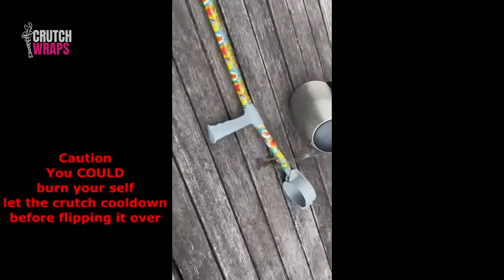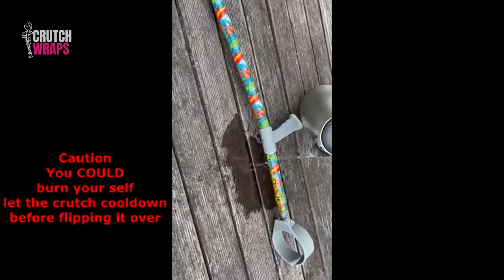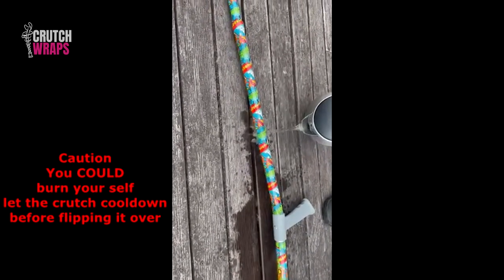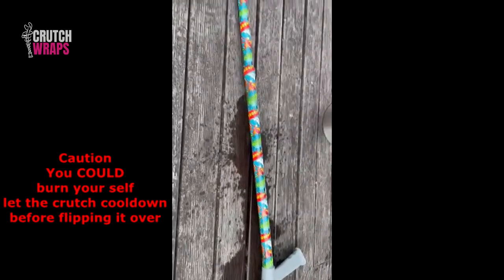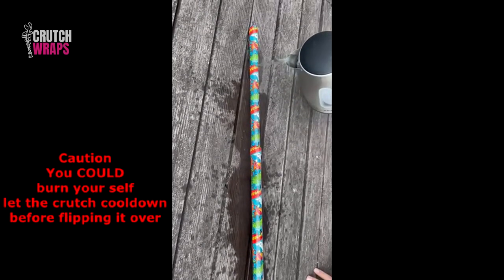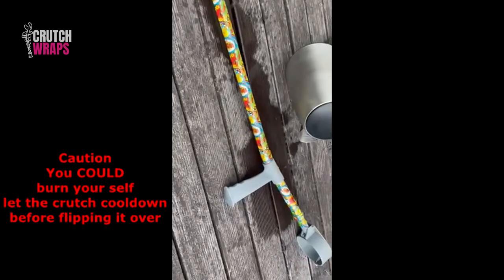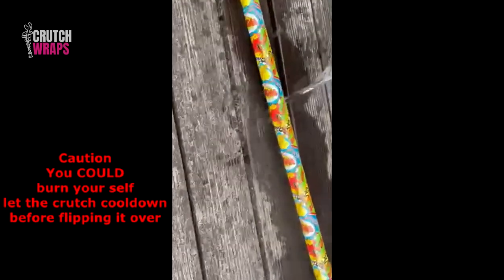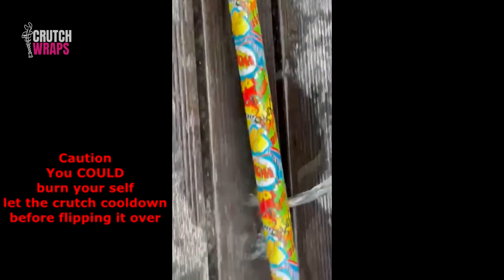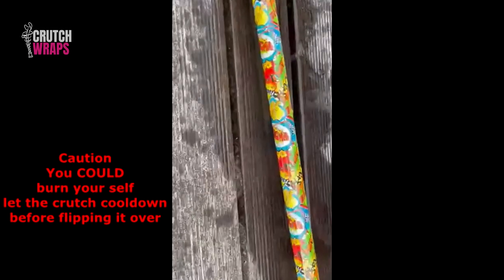Take your crutch to a suitable area for hot water to be poured onto the crutch, either outdoors or a bathtub. Be careful as this part is dangerous.